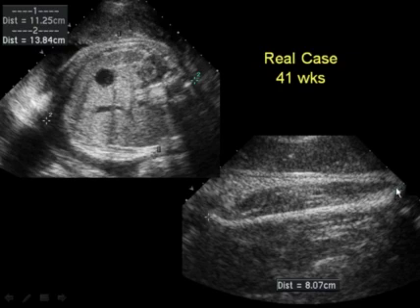And this is the distal end, and here's the distal femoral point heading down. A better spot, or more accurate spot, to put the cursor would be right here. And this end, again, you don't have the sharp end, and it's difficult to know where exactly on this curve is the correct spot for the femur.